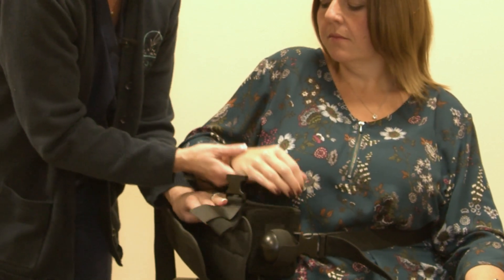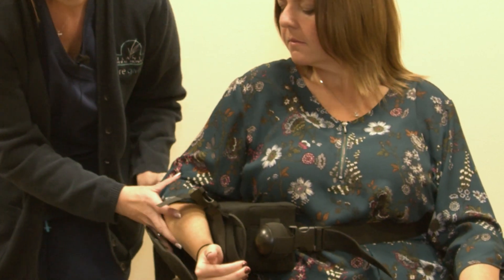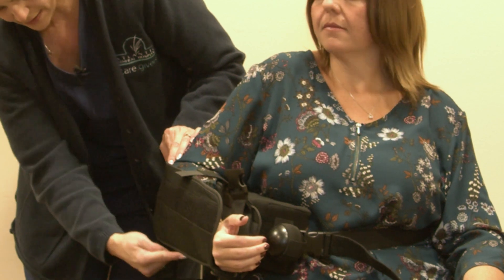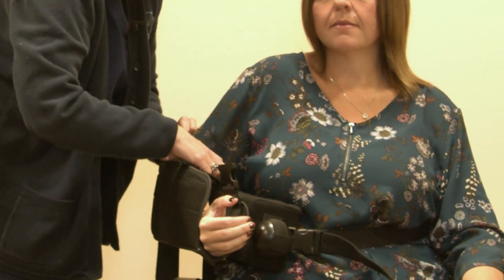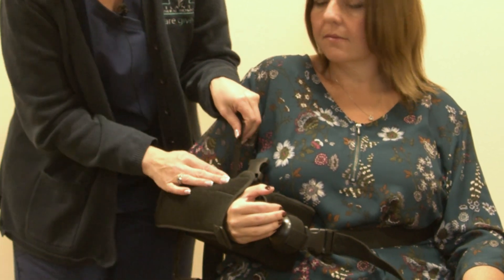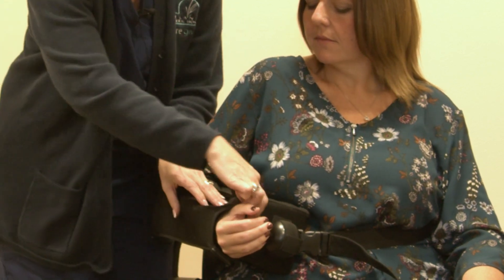And gently place her arm inside, making sure that her elbow slides back to where the seam makes an L-shape. I'm going to attach the short strap so her arm is secure in the sling.